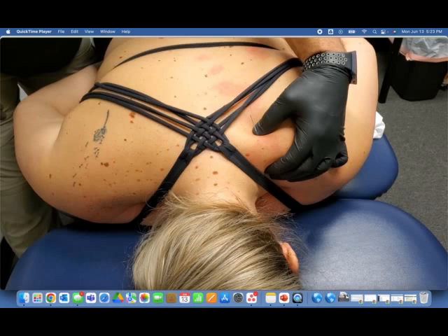And again, with the upper trap, really and truly you're getting some of the upper trap here and you get a response out of there, but it usually clinically works better if you target both of these individually.